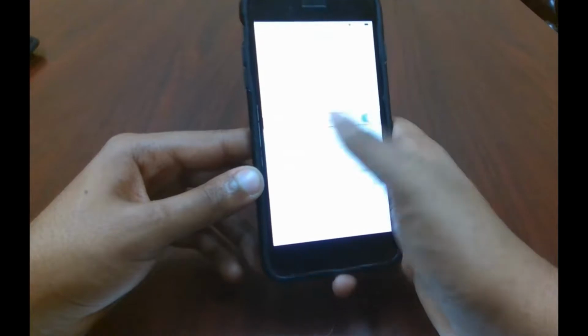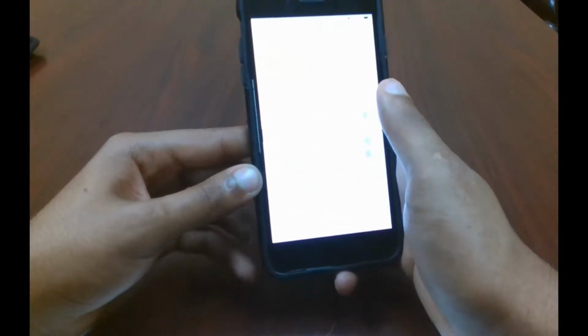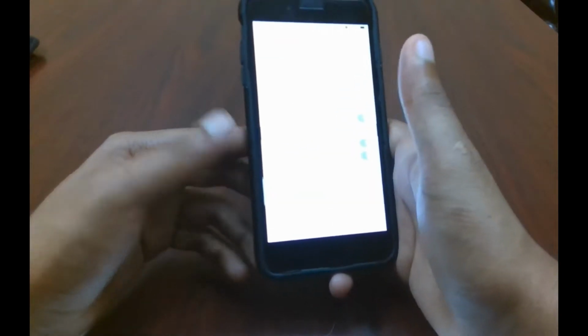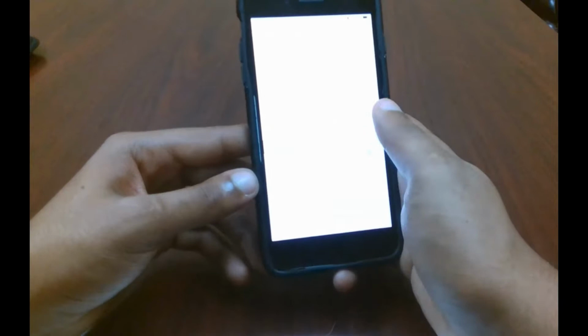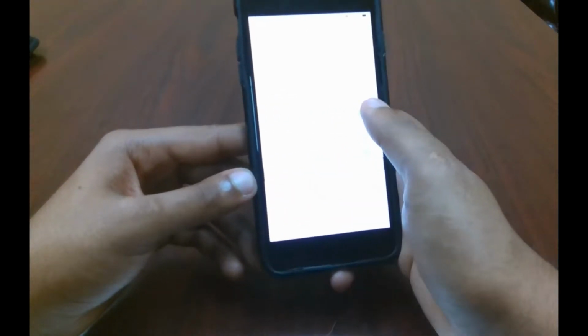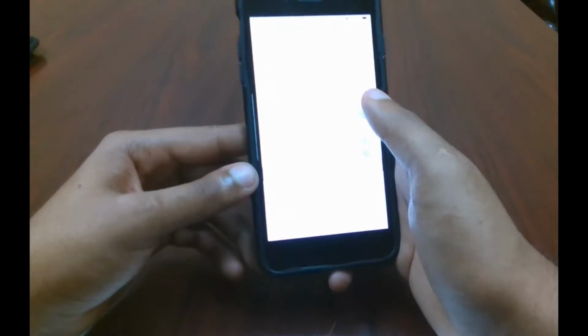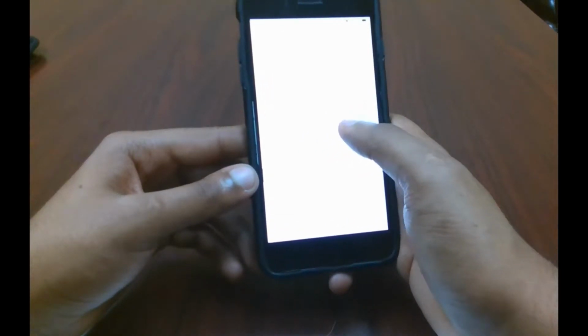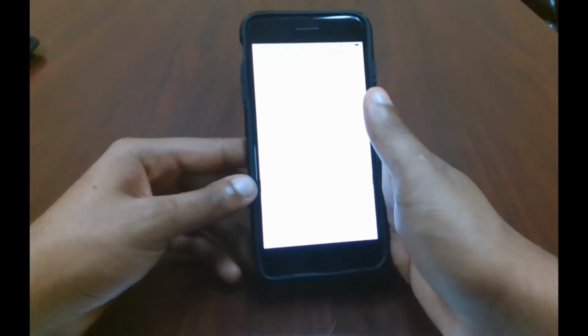Equations use Nemeth code on. Show on-screen keyboard off, which is more of a personal preference. We can get into it later. So Braille code is English Unified, which is the current version of Braille that is accepted, also known as UEB.